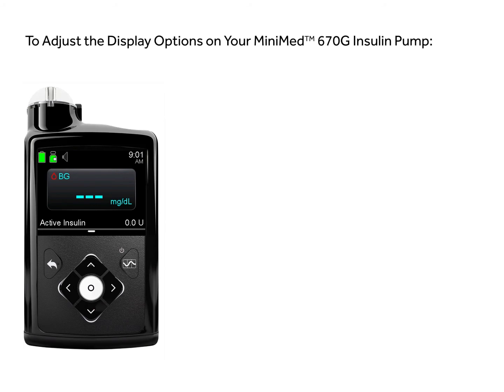This video will show you how to adjust the display options on your MiniMed 670G insulin pump.